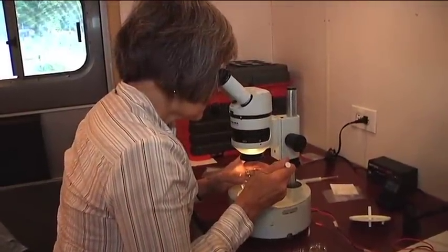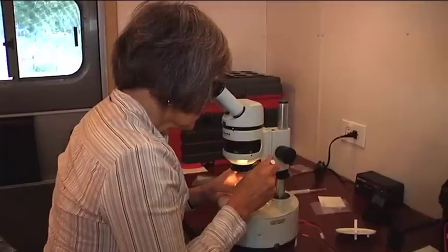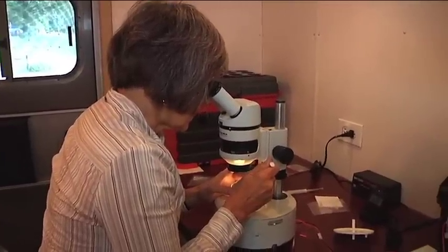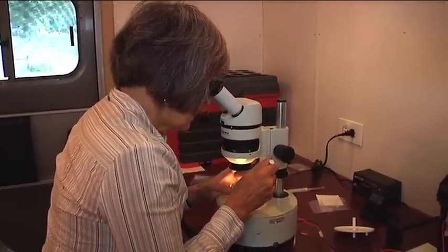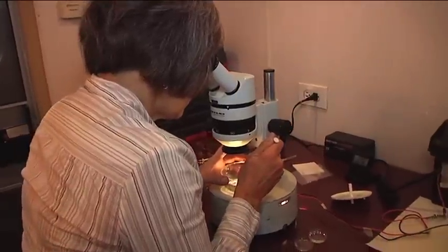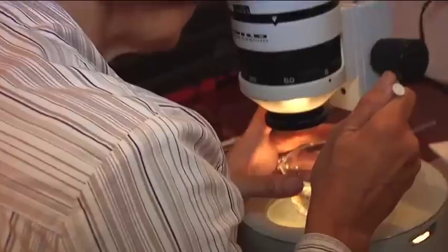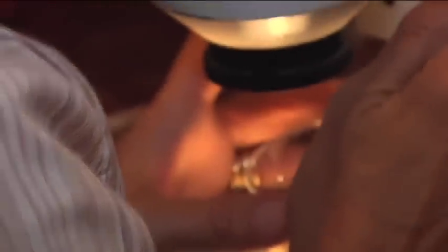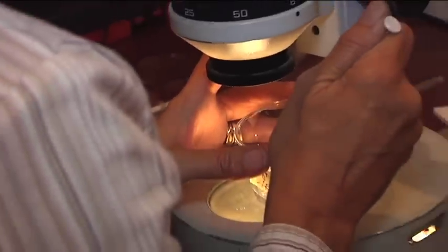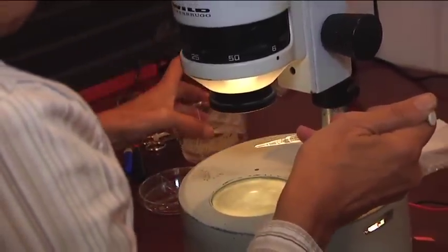Once the embryos have been collected, they are separated under a microscope and stored. When an embryo is found, it is picked up with the tip and placed over into a Petri dish.